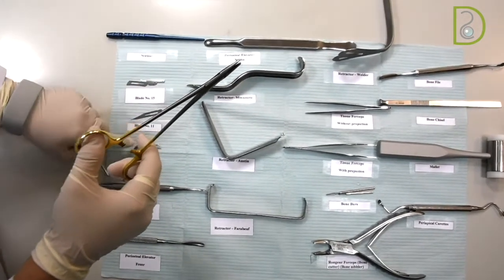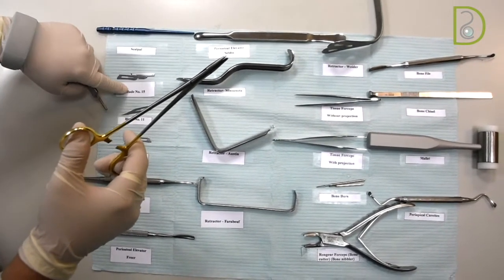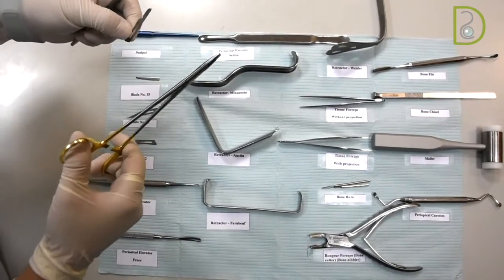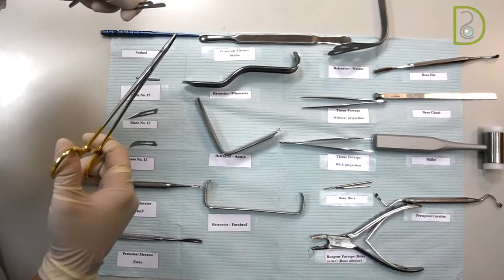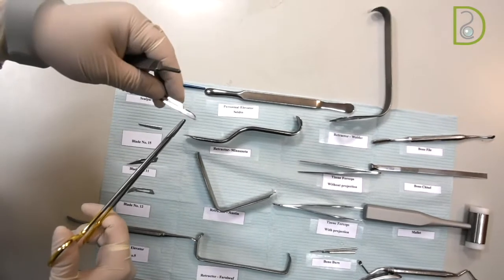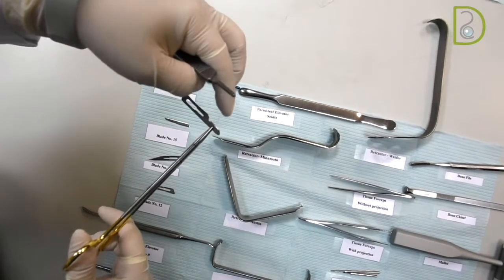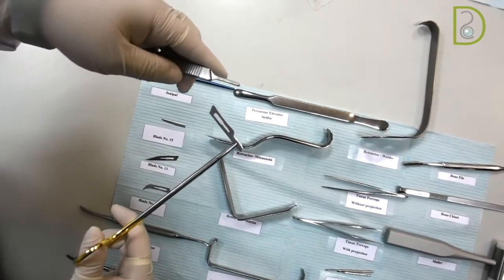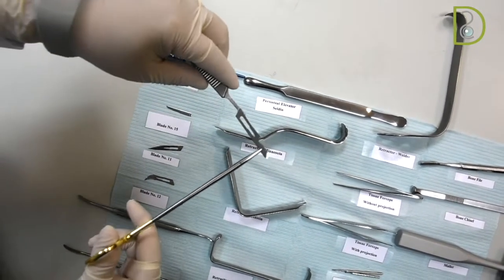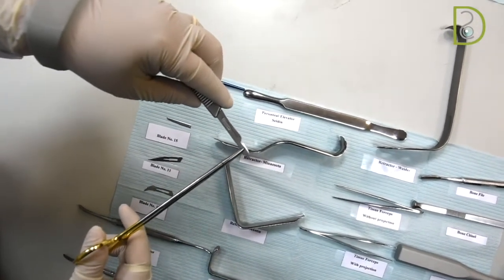Coming to the blades, we have different shapes and sizes. This is blade number 15, which is the most widely used one for making incisions around and designing any flaps. I will show you how to feed the blade holder by holding the blade from the back, away from the sharp edge, so you will not affect its sharpness. Studying the design, you can see that this angle will match the angle over here. So that means you are holding the blade in the right position.